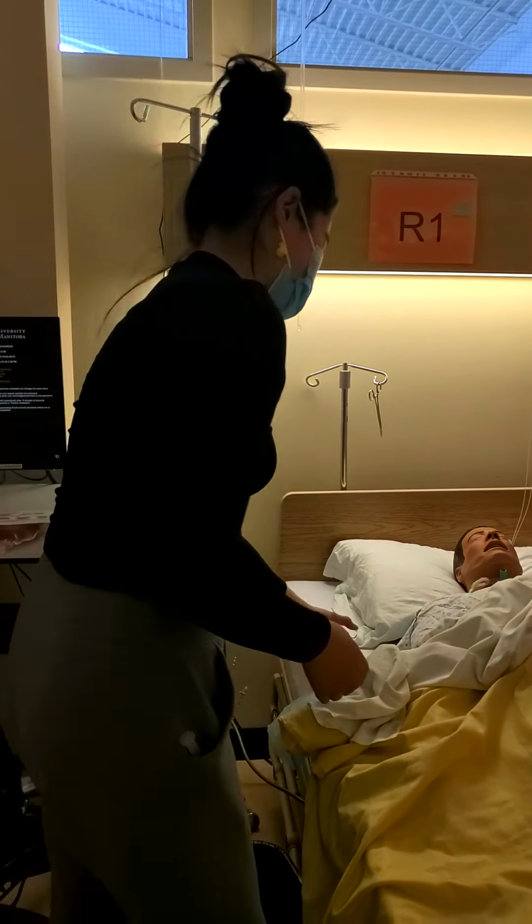And I'm just going to prime my line here. So now I'm going to be starting my feeding. So I'm going to make sure this is clamped first.